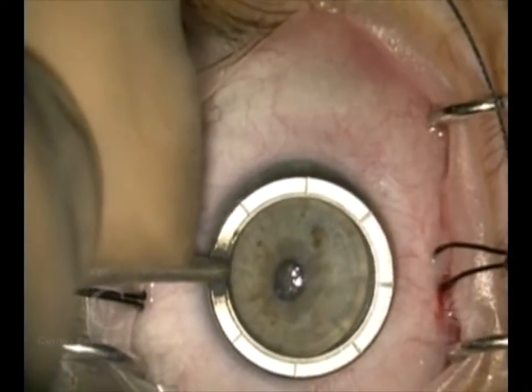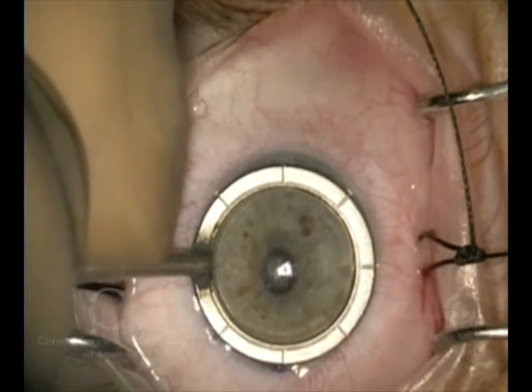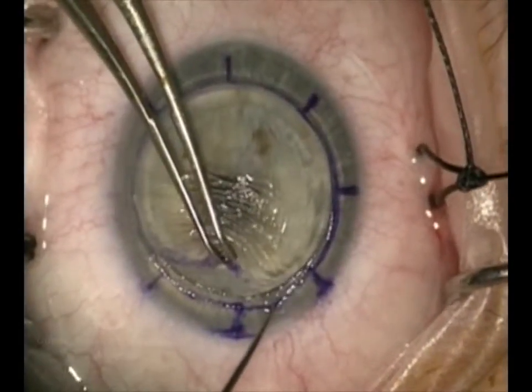Hello, I'm Dr. Francis Price, and this is a case of DALK, Deep Anterior Lamellar Keratoplasty. It's a corneal transplant where we spare the inner layer, Descemet's membrane, and the endothelium.